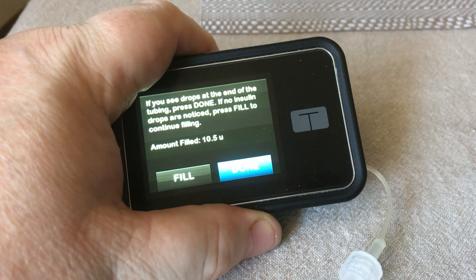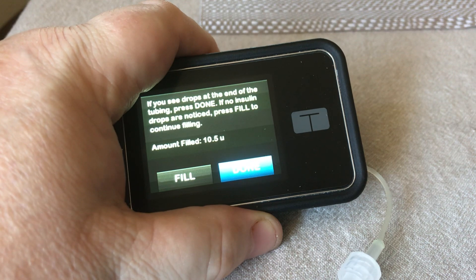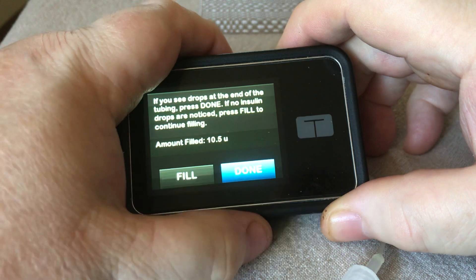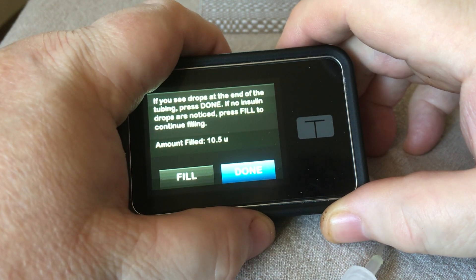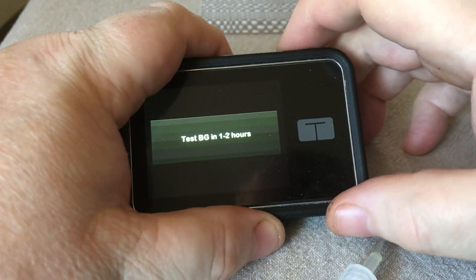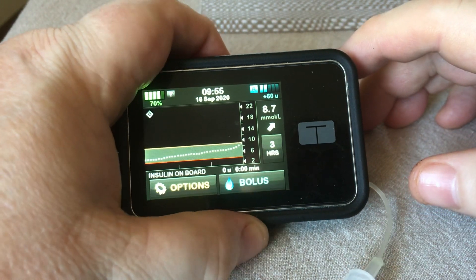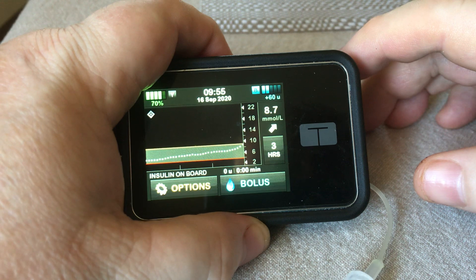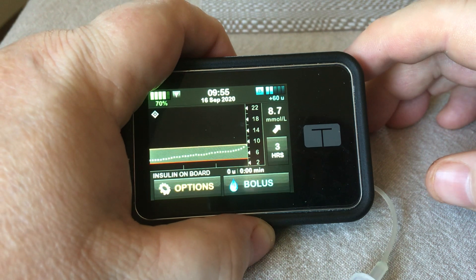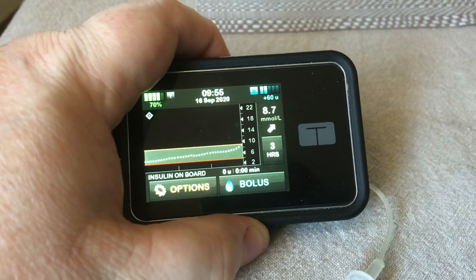Obviously, you saw where I was at 8.9, which is about 160 for the Americans or those using mg/dL. So it says it's used 10.5, but actually it hasn't used any because the cartridge wasn't in place. And complete the process — done. Saying 60 plus. And that's all complete. The cartridge has been reloaded. I've not disconnected, I've not wasted any insulin, and I'm good to go for another 24 hours. Bye now.